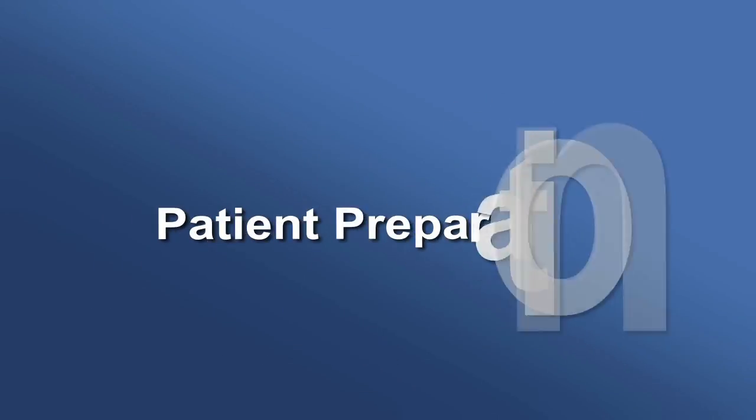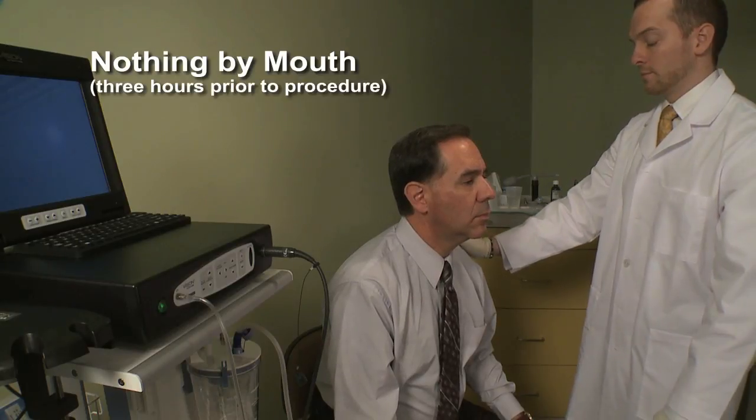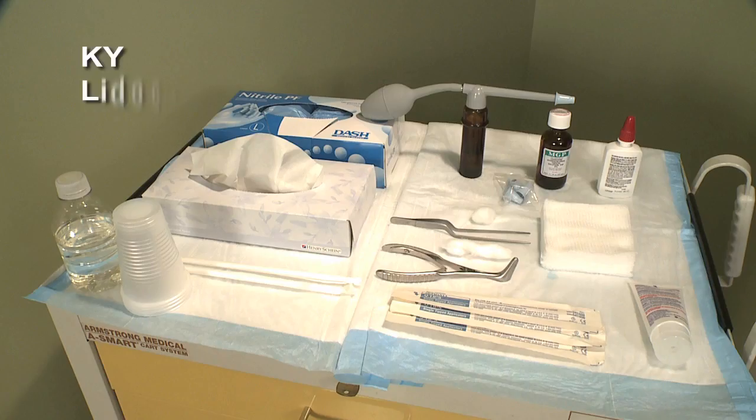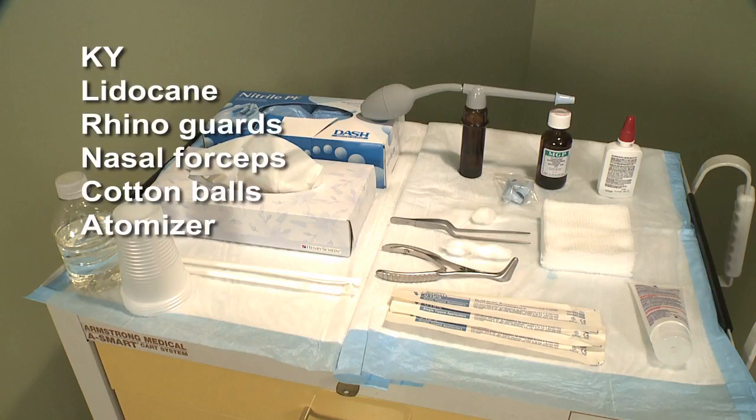Patient preparation. Patients are typically advised to have nothing to eat for two to three hours prior to the procedure. The following are some commonly used techniques used to decongest and numb the nose prior to the procedure.